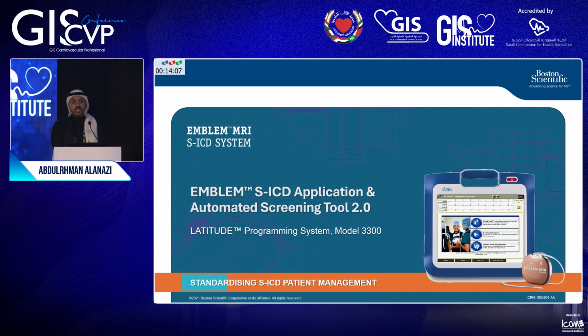What I need you to do is think about an external AED. The device will work on ECG signals to see the signals, analyze them, then give the therapy upon the decision that it will make. Earlier, Boston Scientific people were doing the SICD screening manually.